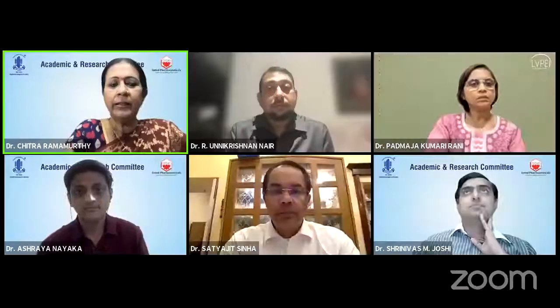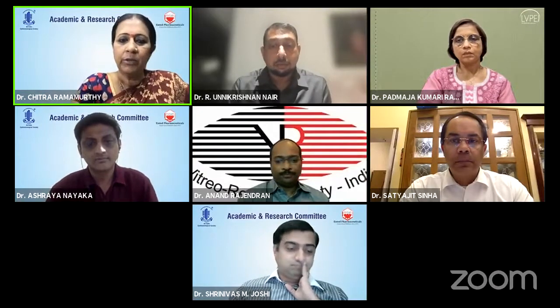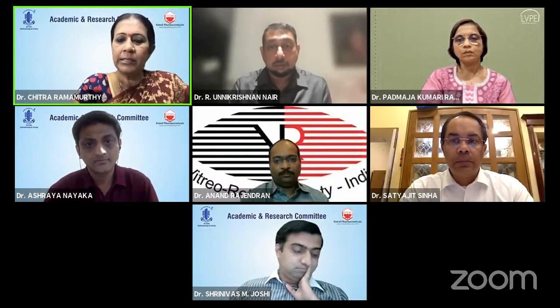Dr. Ashraya, that was a wonderful talk, quite complex. But does it mean that its use is limited in clinical decision taking because it's sort of a late clinical marker and has less predictive value?